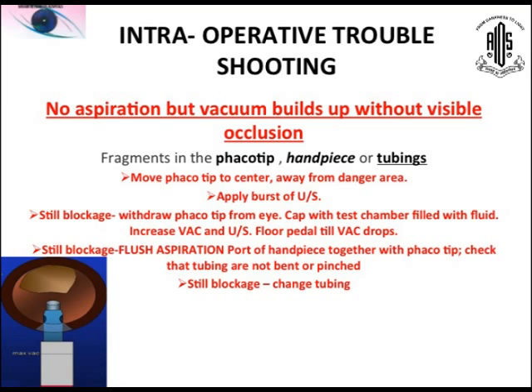Believe me, all of you have to know this. Don't leave it to your assistant or your scrub nurse. You have to know how to connect the phaco handpiece and how to remove the blockage. Still the blockage: change the tubing.